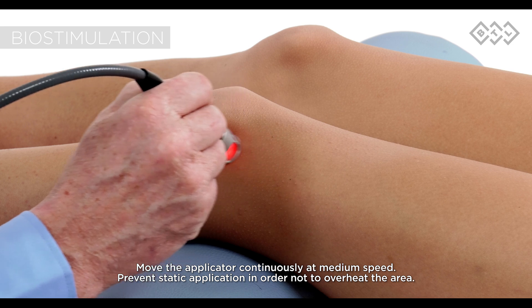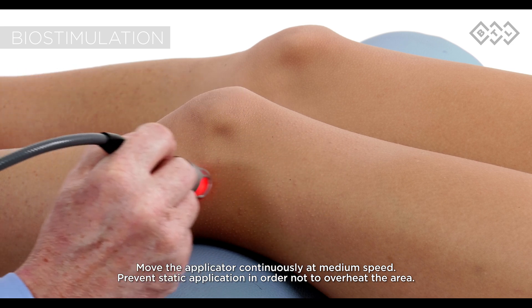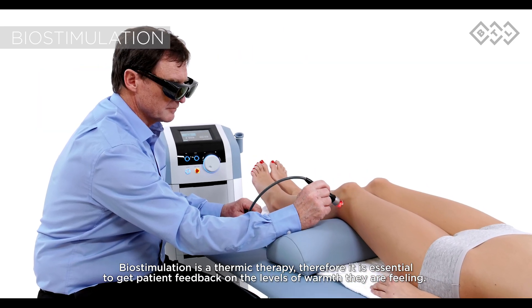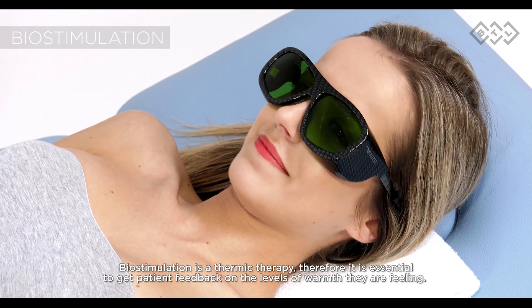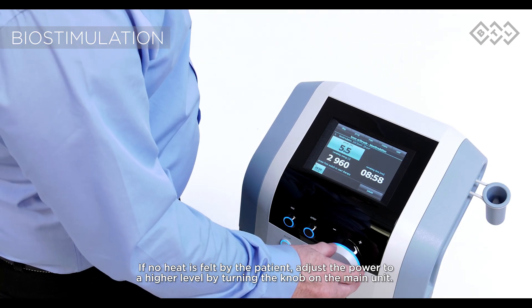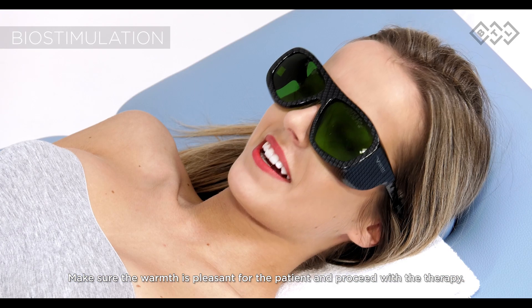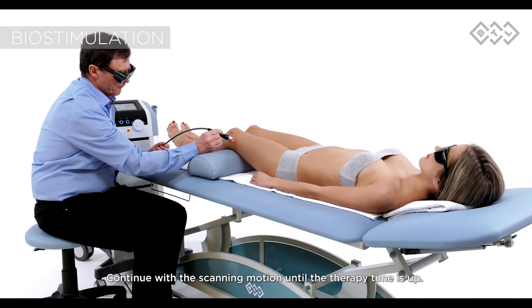Move the applicator continuously at medium speed. Prevent static application in order not to overheat the area. Biostimulation is a thermic therapy, therefore it is essential to get patient feedback on the levels of warmth they are feeling. If no heat is felt by the patient, adjust the power to a higher level by turning the knob on the main unit. Make sure the warmth is pleasant for the patient and proceed with the therapy. Continue with the scanning motion until the therapy time is up.